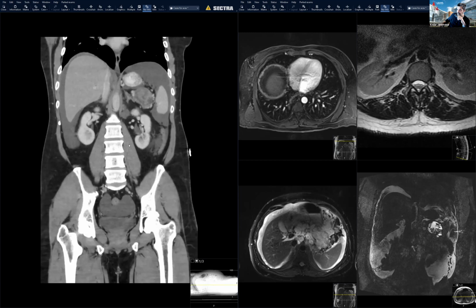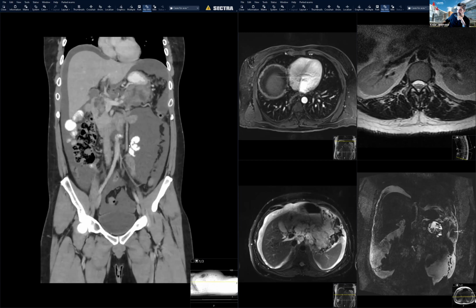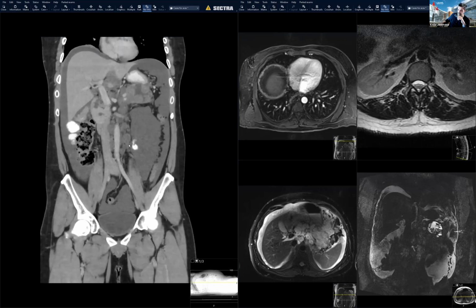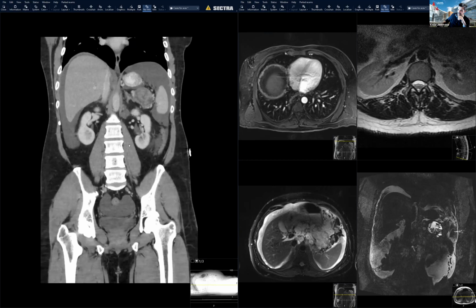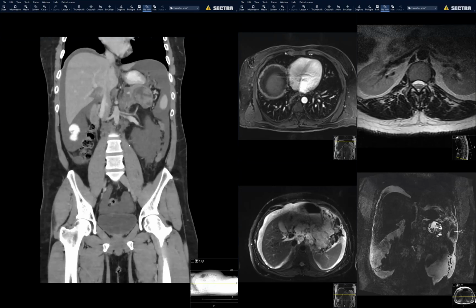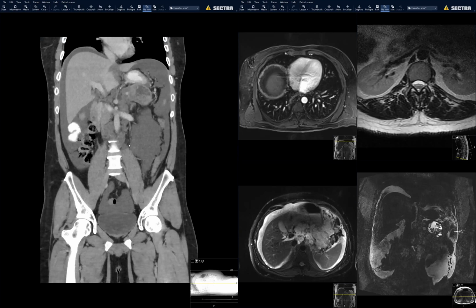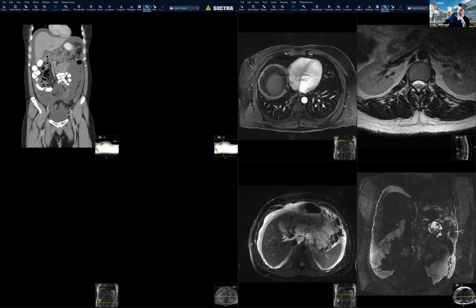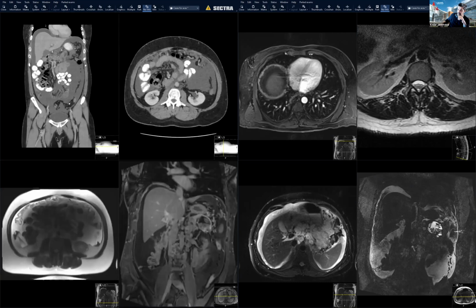So you said either lymphoma, which is one of the thoughts that we had. And the other thing based on the CT we thought was, can it be some unusual acinar cell type of carcinoma? Yeah, or a neuroendocrine sometimes can grow along like that. Or a neuroendocrine tumor, exactly. So his CA 19-9 was elevated. His CEA was normal.